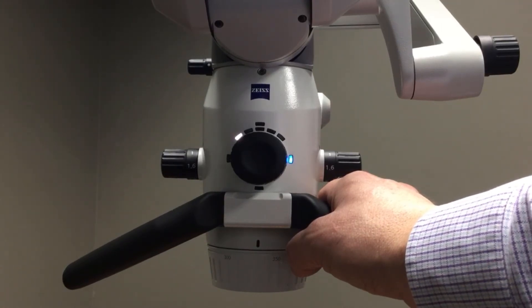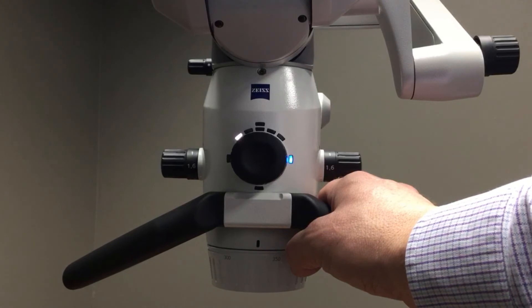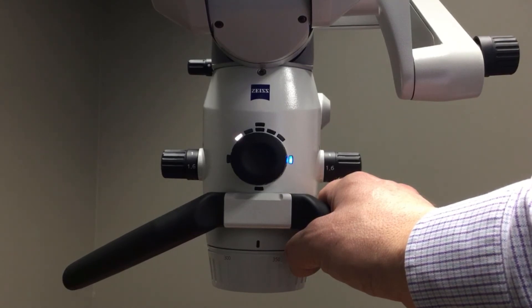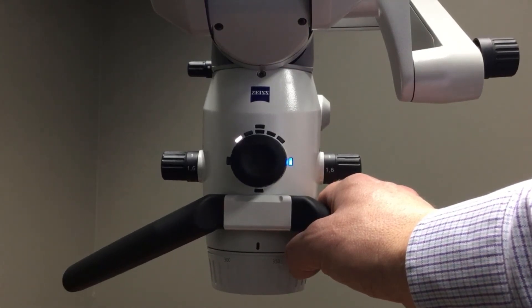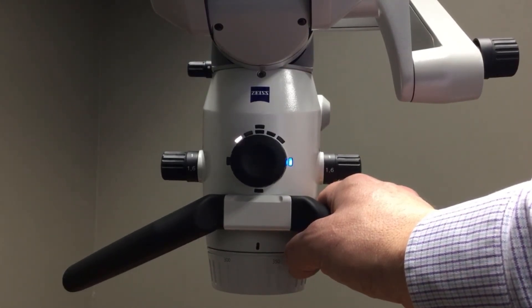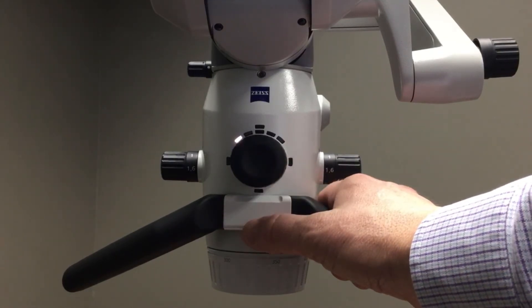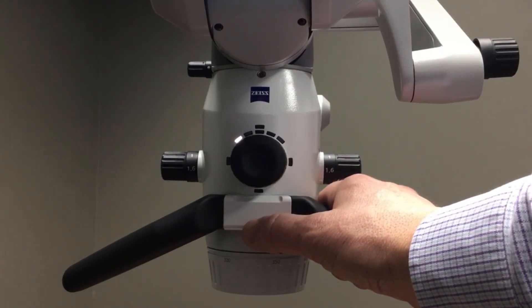True light is much kinder to the eyes, and the light it produces gives a true representation of hard and soft tissue. It is color accurate to help you with ideal shade matching of composites when matching them to tooth structure. To turn off true light, I simply depress the three o'clock position again.